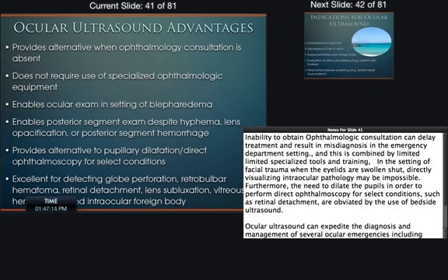And blepharedema, that's a word that means there's a lot of swelling around the eyelid, so it's hard to see. It's hard to retract the eyelid. It's blocking it. In those patients that have a lot of edema or swelling there, the ultrasound is very useful, because you just put gel over the eyelid and look through the gel, through the closed eyelid, to see the eye. So even when someone's eyelid is so swollen, you can still do this exam, and you can see all the anatomy of the eye.